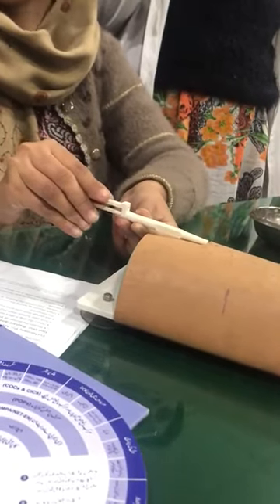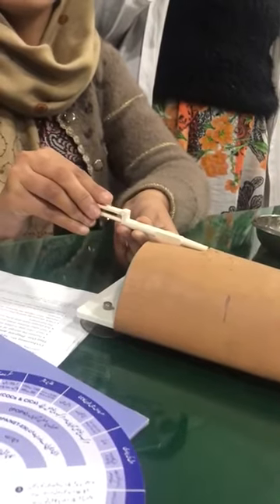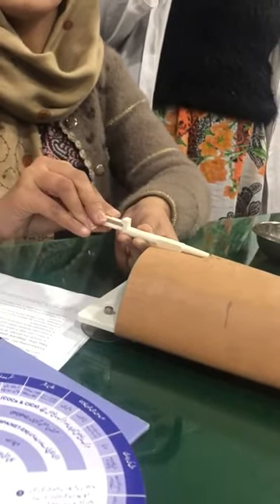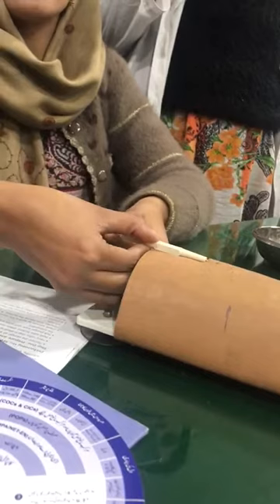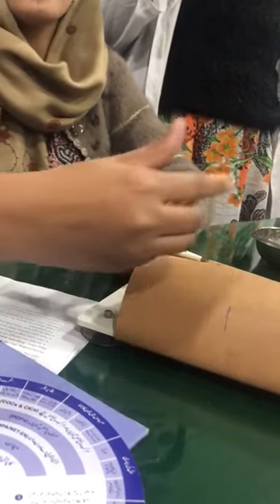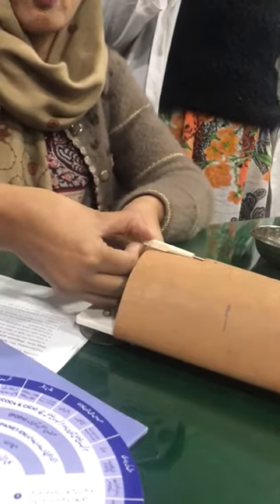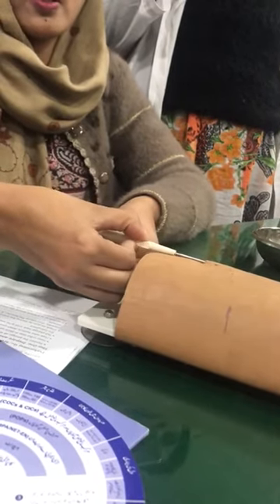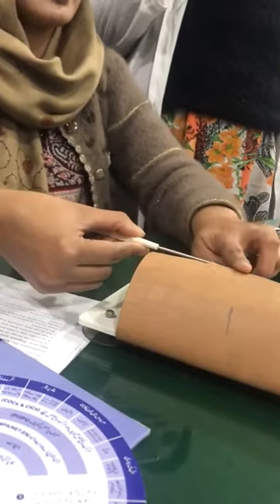This is the seal. The seal will be engaged here. Rotate the step to release. Slide the cannula back while holding the obturator steady — this will release and deposit the capsule in place.